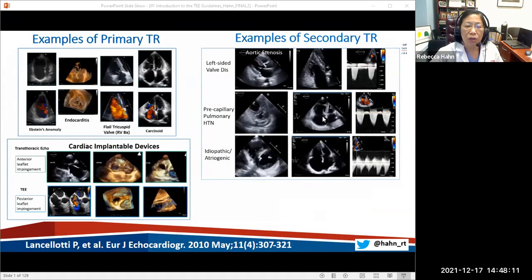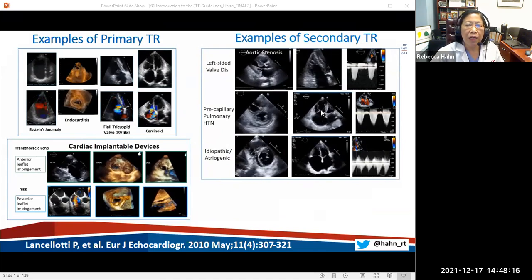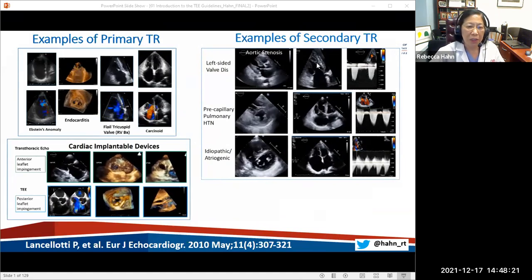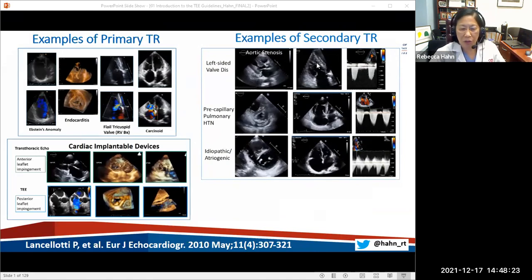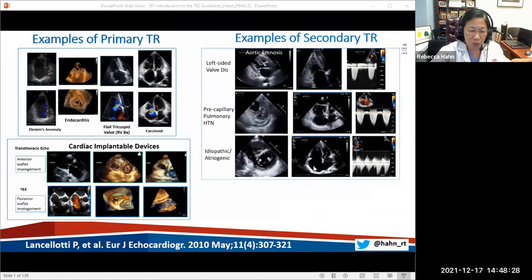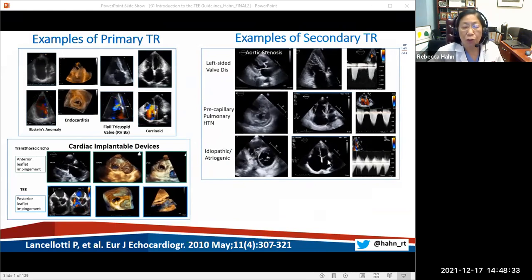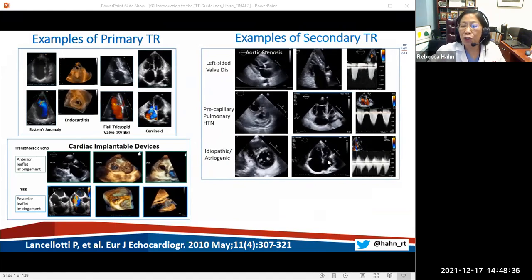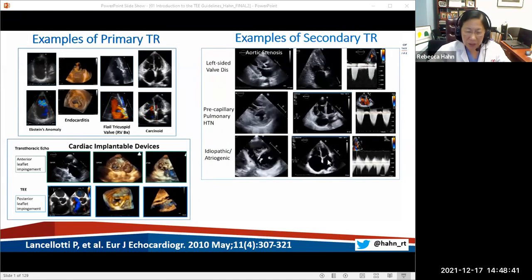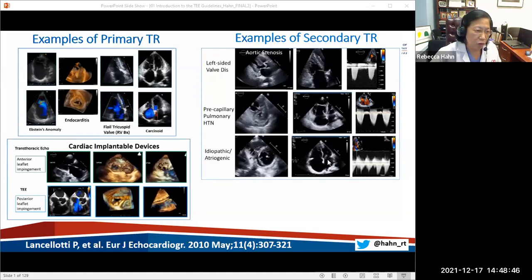The most dramatic is with the primary pulmonary hypertension, so precapillary pulmonary hypertension. But you'll also see it anytime you have dilatation of the RV and any displacement of the papillary muscles, either the anterior, posterior, or the septal. And the atrial function are the ones that have the biggest right atria. They tend to have the biggest, and then the leaflets are closing closer to the annular plane, almost at the annular plane. And the issue becomes that with chronicity of the disease, then you begin to get more and more RV dilatation. And in that setting, you now can have some tethering, even with atrial functional disease.